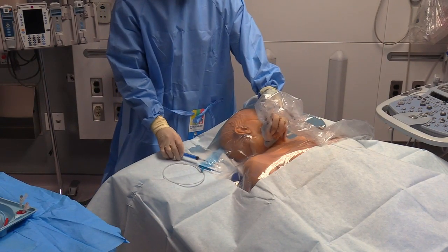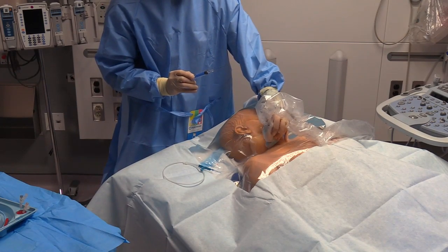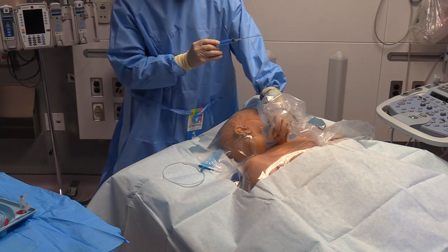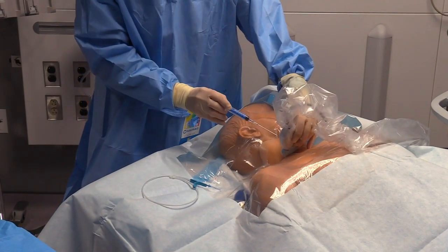I've identified what looks like the vein, although in real life it looks definitely different than this. There's not usually a bright white structure around it, but we'll work with what we got here. And oftentimes you want to have the needle guide on in the middle just because it guides the middle of your screen. It makes it easier to know exactly where you're going to go in.